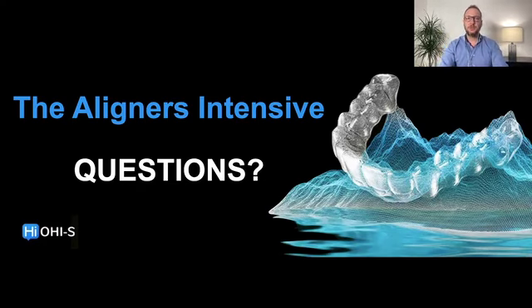Then I like to take 2 photos in profile, one in the rest in the same way with the lips open, and the other in the full smile. So with the same head position of the patient, full smile, I take frontal view and in profile, and the rest showing with the lips open in frontal view and in profile.